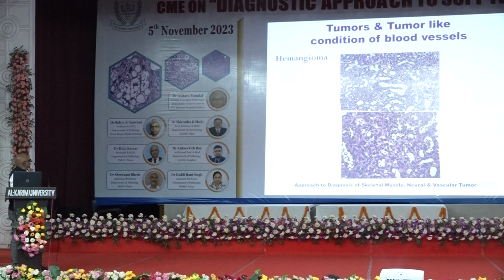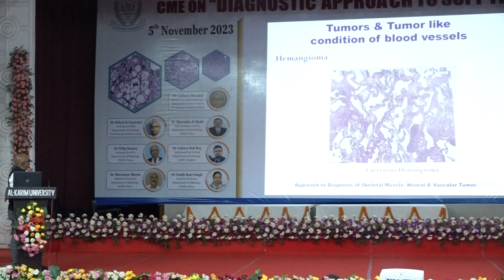These are the microscopic features of this hemangioma. The endothelial cells. This is the cavernous hemangioma. See this thick wall, dilated areas.